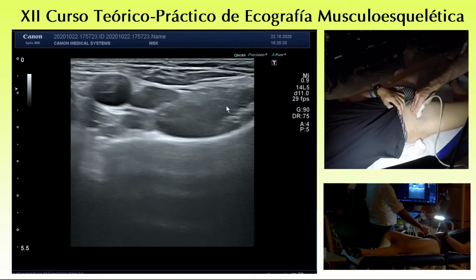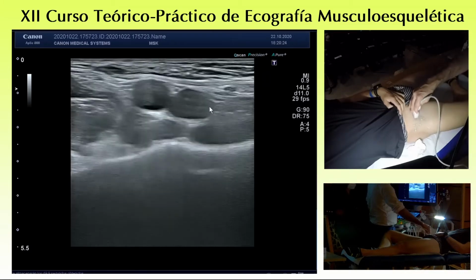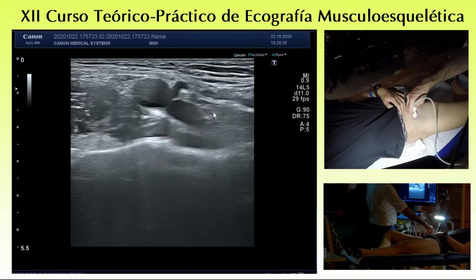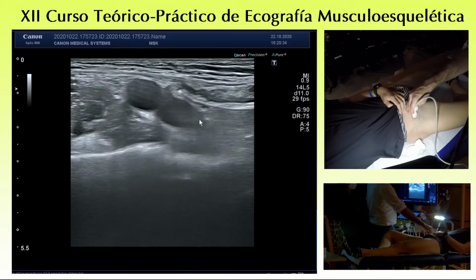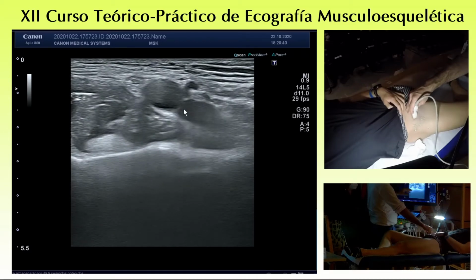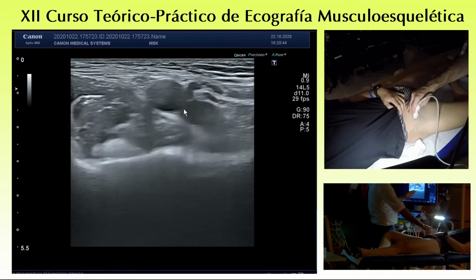When a patient is complaining of pain, moreover if female, go a bit up here and ask to perform a Valsalva maneuver. Try to do Valsalva, okay. You see the femoral vein enlarge. When the femoral vein enlarges, you are sure that there is no femoral hernia.